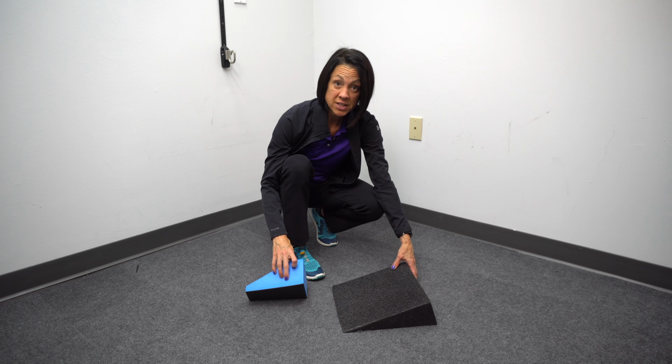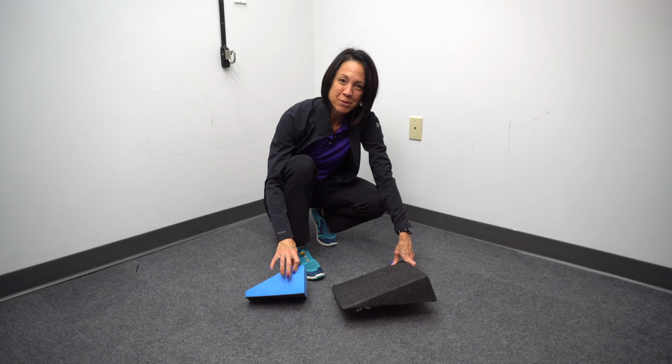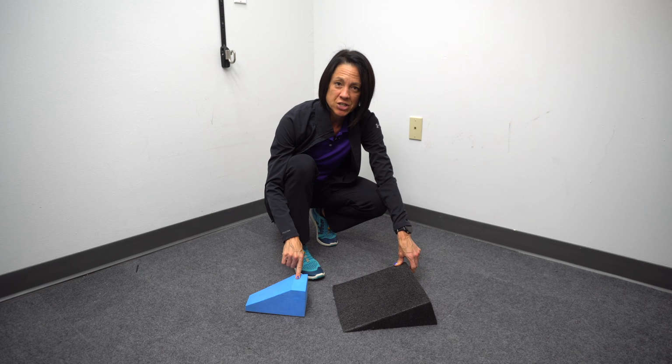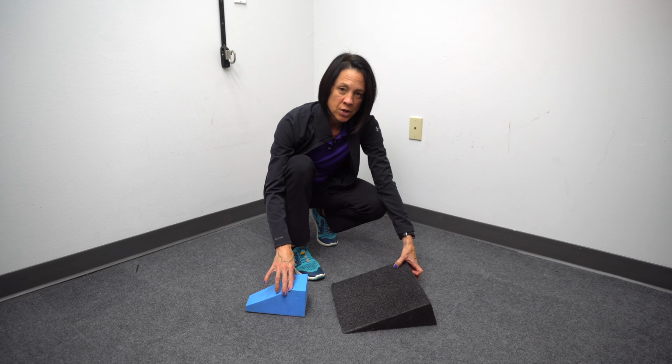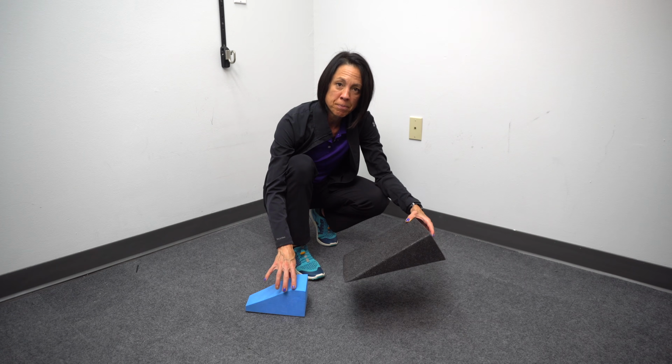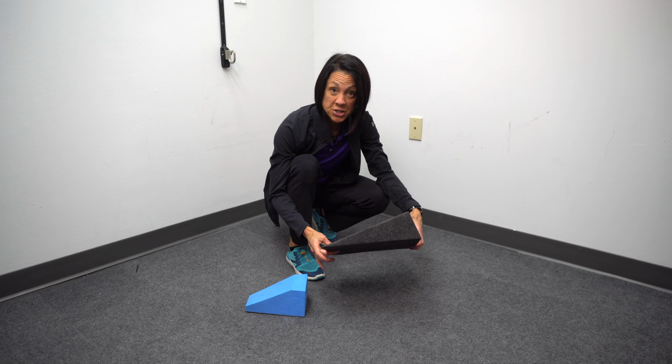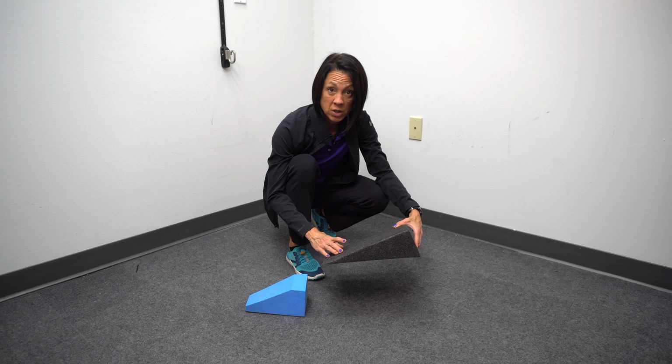All right, now the first thing that we're going to talk about, and a lot of you guys have seen me use these in a lot of videos, but I want to describe the difference. So there are two different wedges that I have here. Now, the nice thing about this one is that it's a little bit bigger, and it will be good for some of the stretching that we do to stretch the lower leg out.